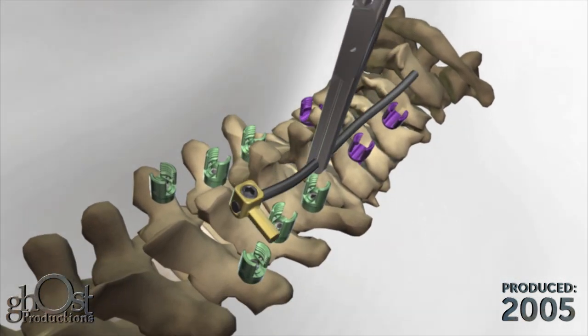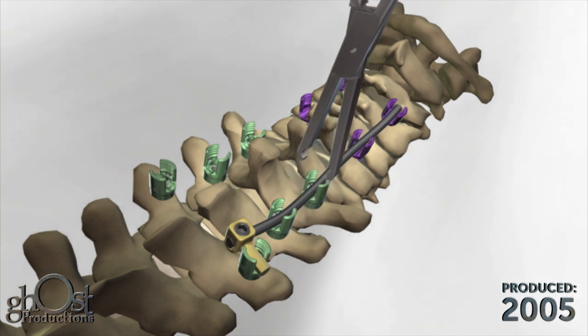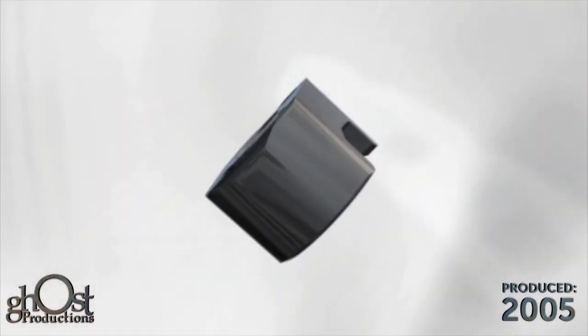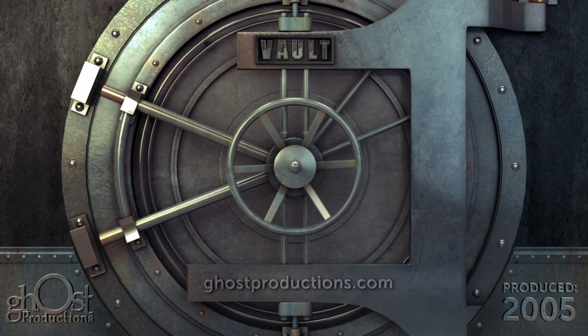Insert the rod into the construct using the rod holder. The rod is locked to the screw using a locking cap. The loader is used to place the locking cap onto the seat.